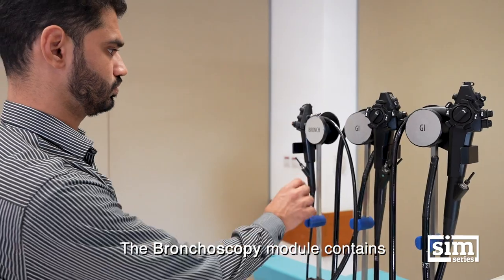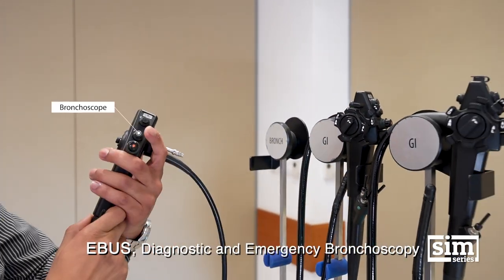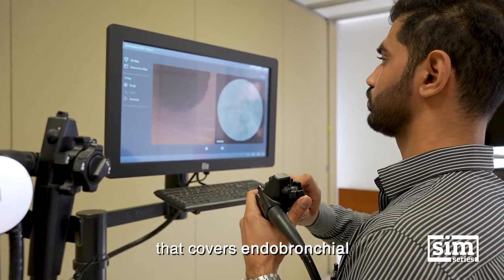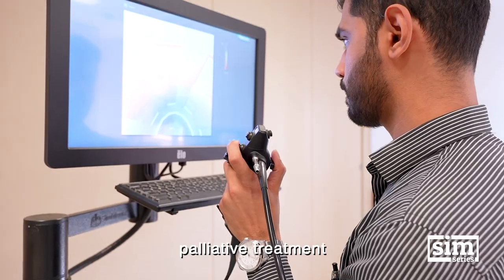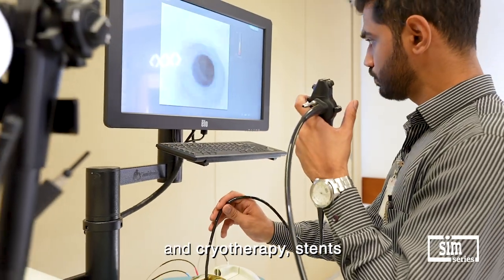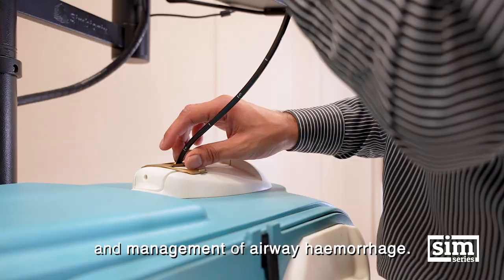The Bronchoscopy module contains EBUS, Diagnostic and Emergency Bronchoscopy that covers endobronchial palliative treatment with electrocautery, Argon Plasma and cryotherapy stents and management of airway hemorrhage.